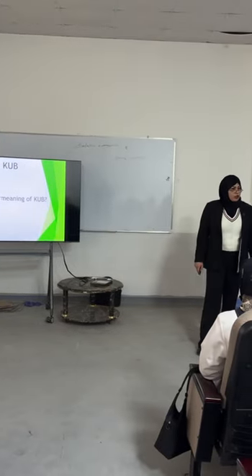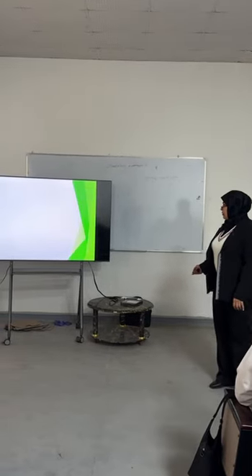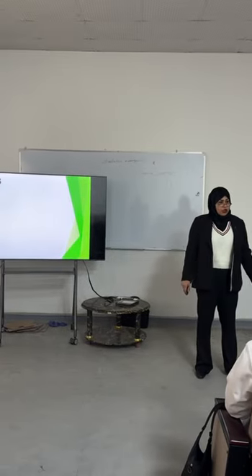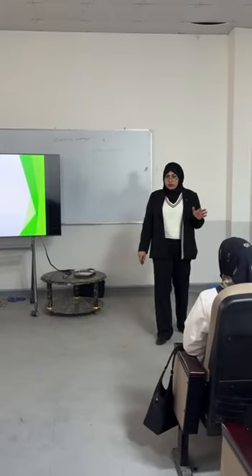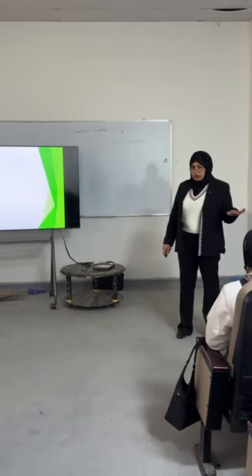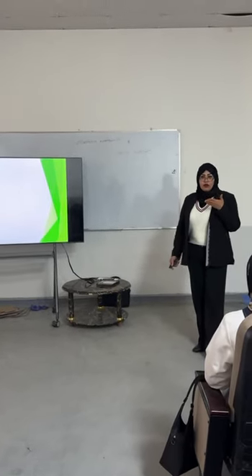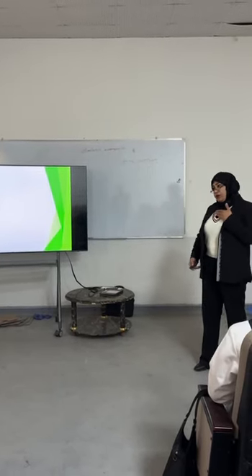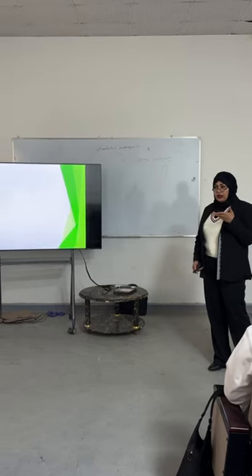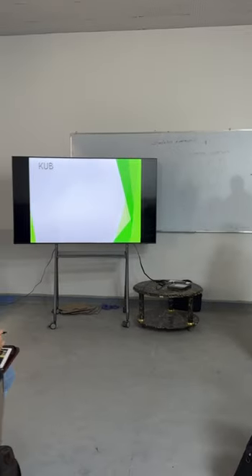KUB, what is the meaning of KUB? Excellent. How can we do it? How can we take a KUB for the patient? Supine. Inside the X-ray department, there is a tray. We put the patient on it in a supine position, and the film extends from what to what? Below the diaphragm until below the symphysis pubis. Why? To include the whole of the urinary system.